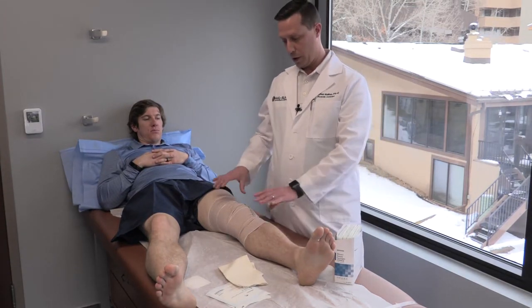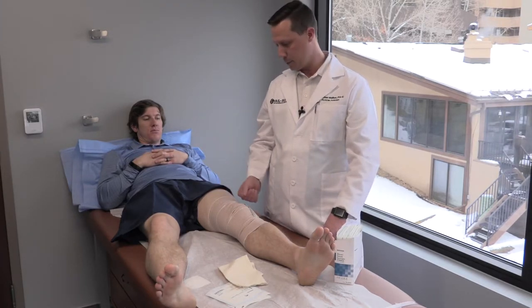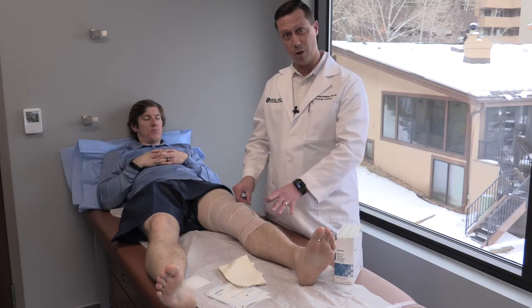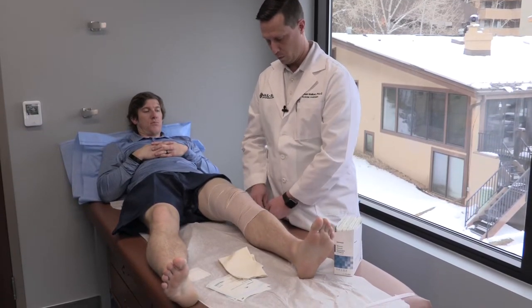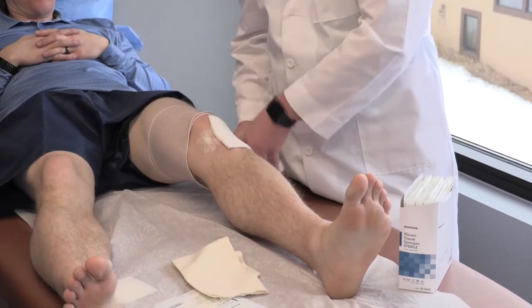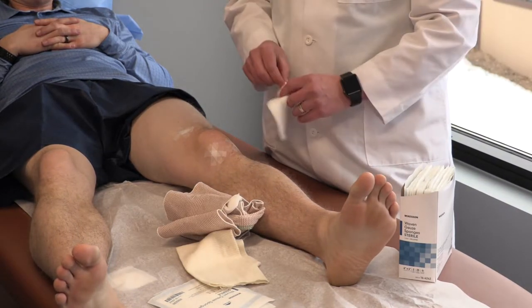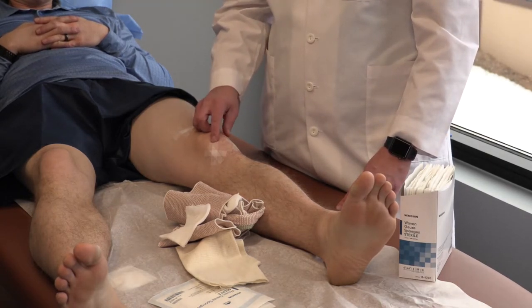You'll typically have your knee wrapped with an ace bandage. Ryan here has the ace bandage on without a whole lot of the other padding underneath, but it'll be easy enough for you to understand. The day after surgery, you can go ahead and take down all of the dressing — just unwrap the ace bandage. Then there'll be another wrap that's usually white, called Webril. And then you'll have some 4x4s and sometimes a little yellow gauze on top of each incision, and then you'll have Steri-Strips on the skin.